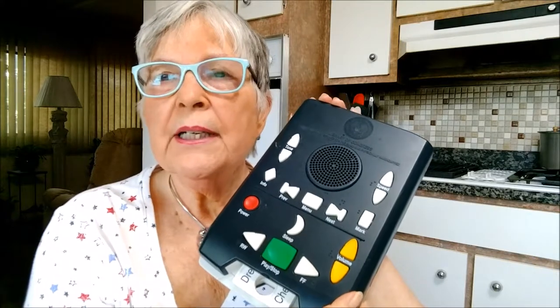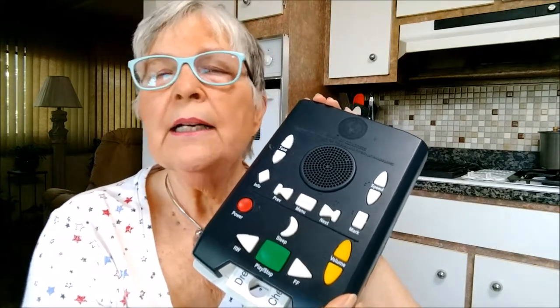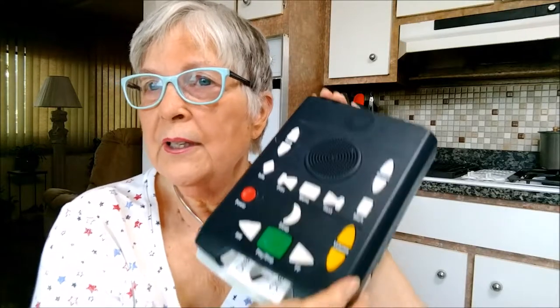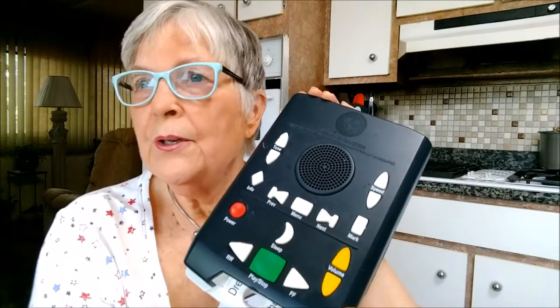Beverly here today to tell you about my very favorite tool: my digital player. My digital player gives me the opportunity to listen to any kind of book I'd like to hear. I love to read, and I can't read anymore, but I can listen to my favorite authors thanks to this device and thanks to the Library of Congress's National Library Service.